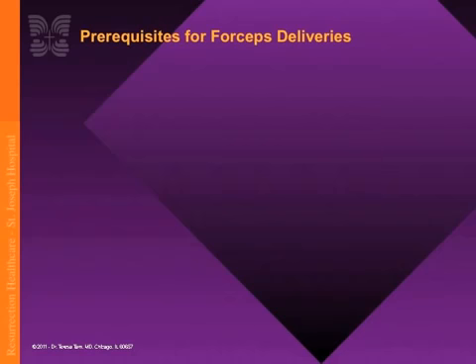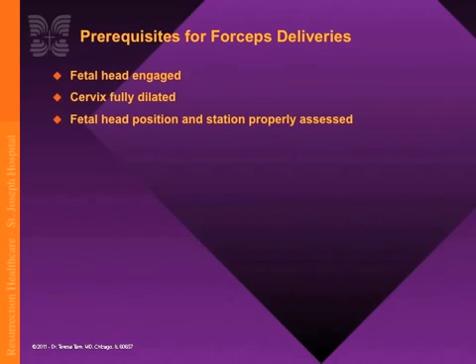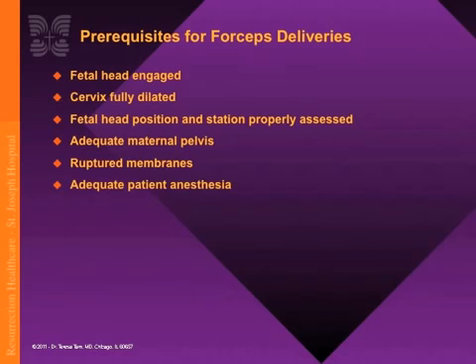Prerequisites for forceps vaginal delivery include the following. Fetal head must be engaged and the cervix fully dilated. Accurately assess fetal head position and station. Evaluate the maternal pelvis to verify a satisfactory outlet. The patient's membranes have to be ruptured. Provide adequate patient anesthesia, either with an epidural or a pudendal block.